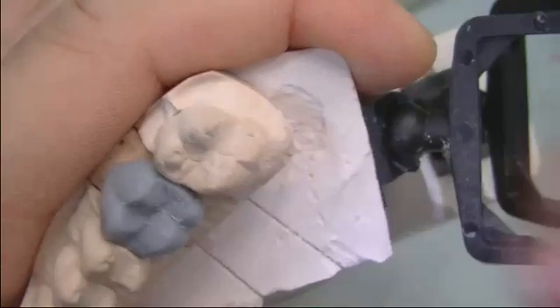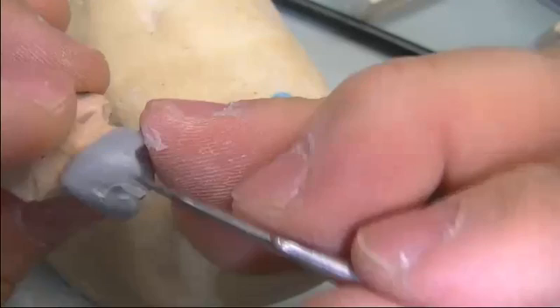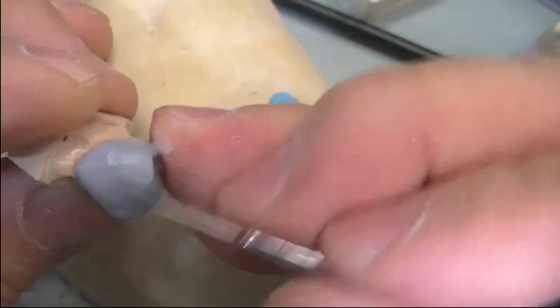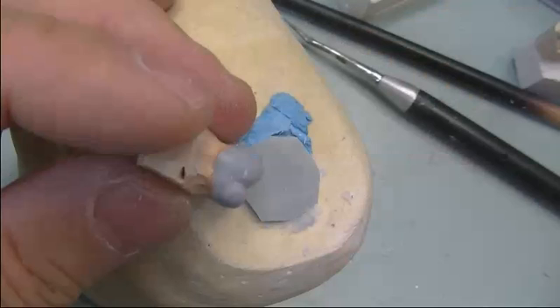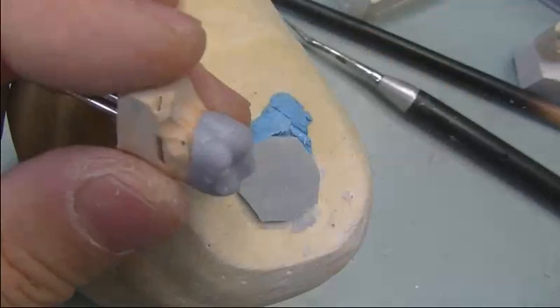Now that we've got most of the cusp tips into occlusion, we remove the die and do a general cleanup to see if there are any deficient areas to be added — in this case, the distal lingual cusp.